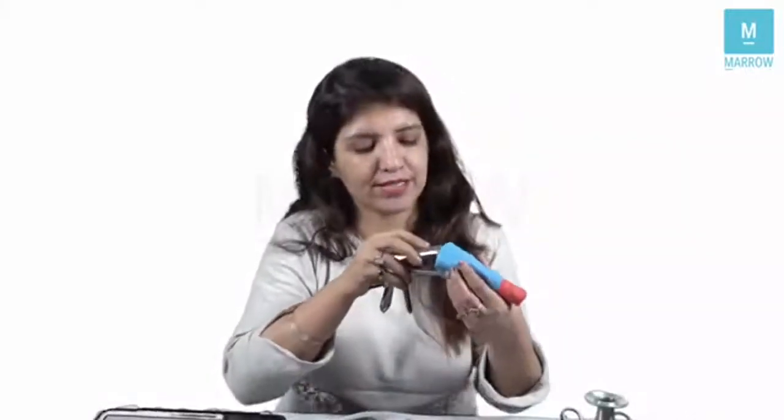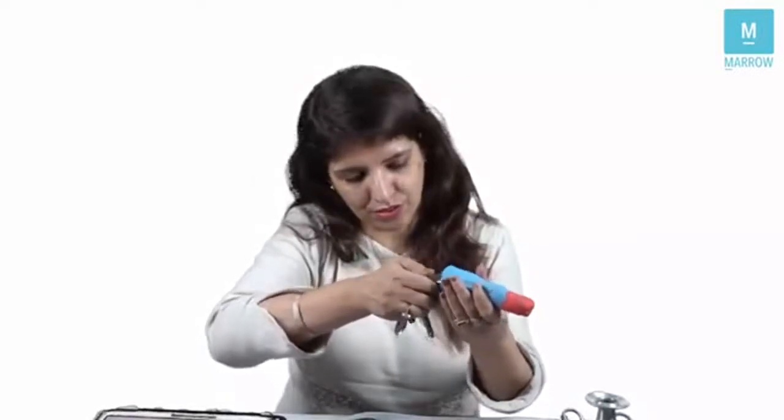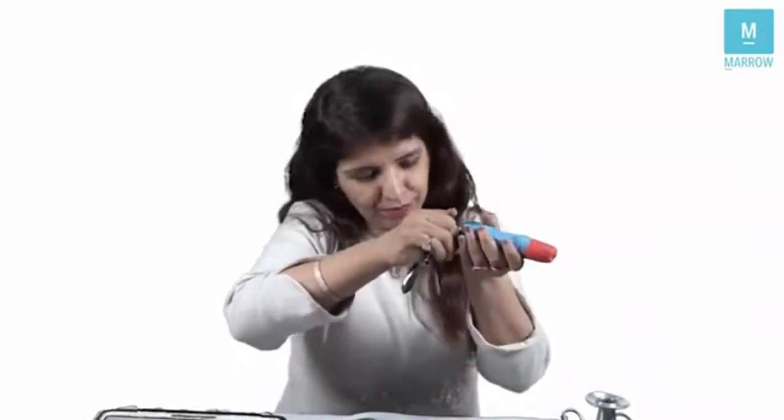Now Cusco's speculum has double blades. So my Cusco's is a little old now, right? Now I am going to insert the Cusco's speculum and then I am going to tighten the screw over here, right? When I tighten the screw over here, the Cusco's is going to tighten and it is a self-retaining speculum. So my hands are now free for whatever procedure I need to do, right? The advantage of Cusco's speculum is that it is self-retaining.